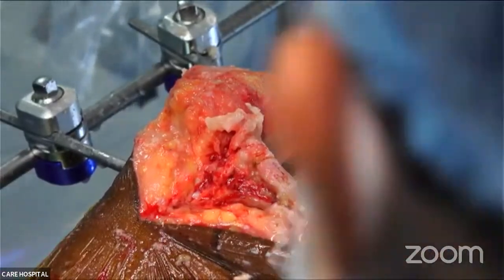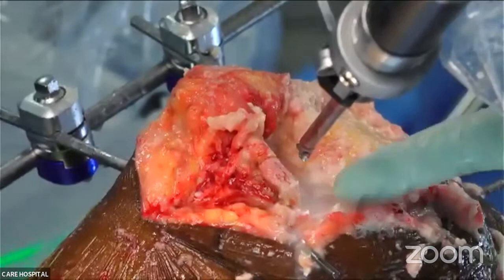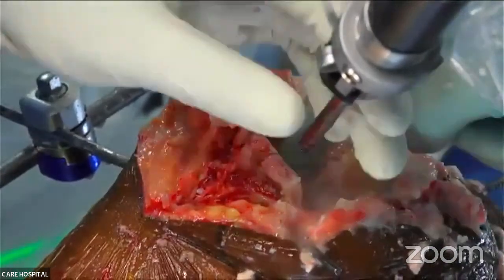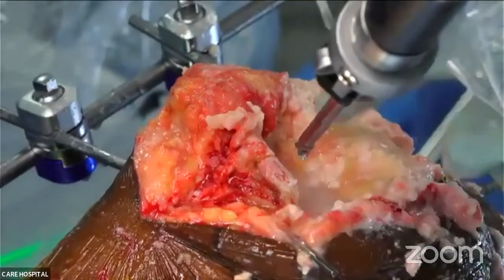Sure. So what we'll do, we'll take the tibial cut first now, because here the tibial eminence is coming in the way of the robotic burr. So we'll take the tibial cut, then it will be easier to take that cut.